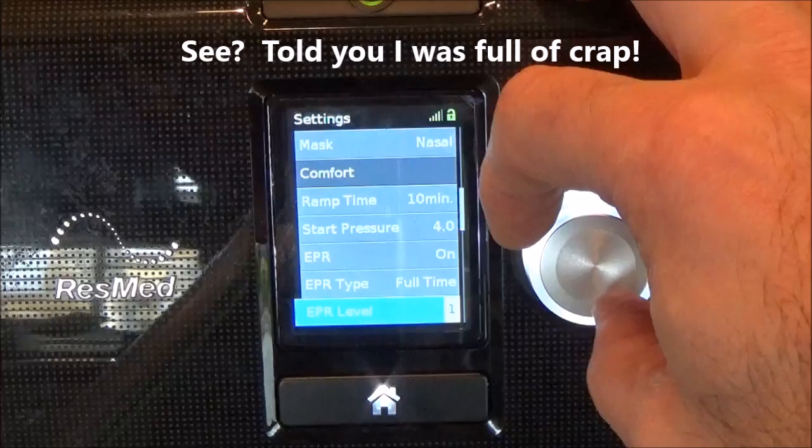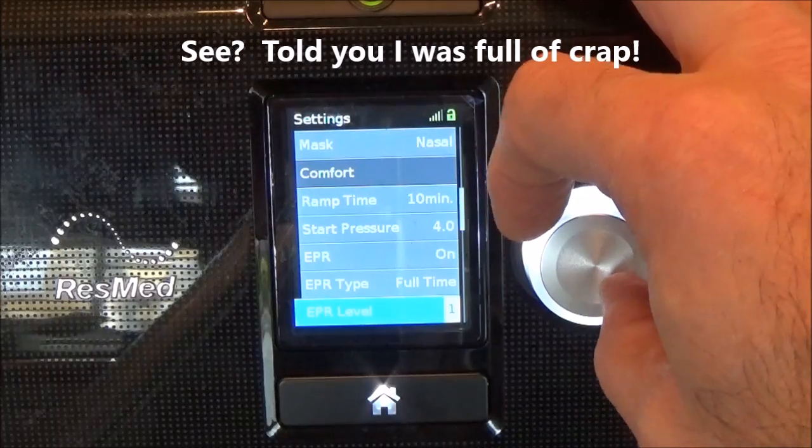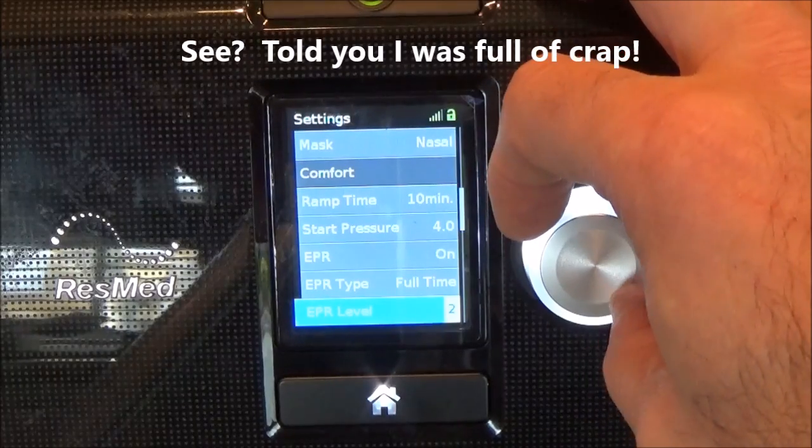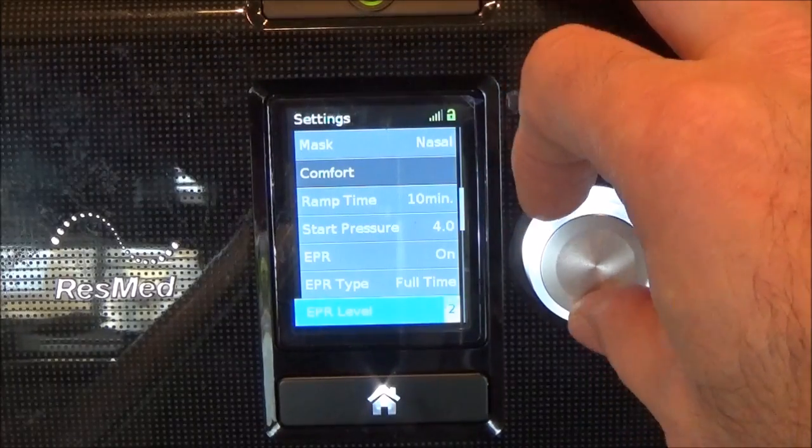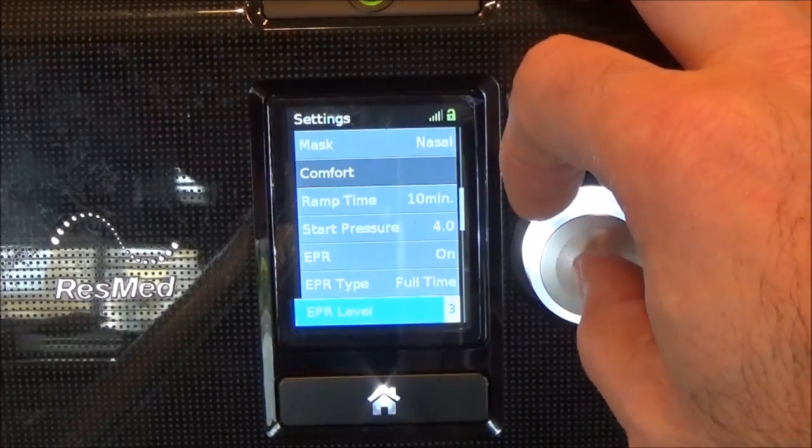This setting represents one centimeter of water pressure decrease, this is two centimeters of water pressure decrease, and this is three centimeters of water pressure decrease.